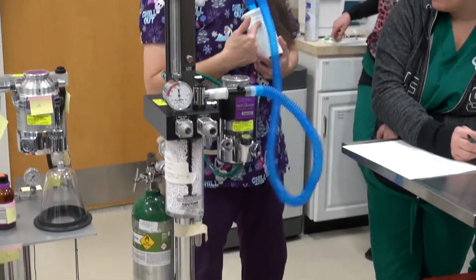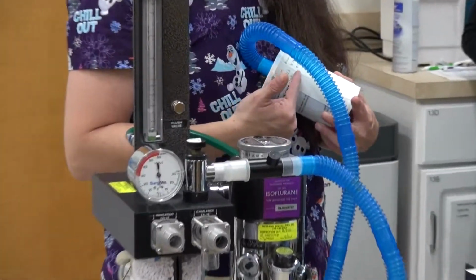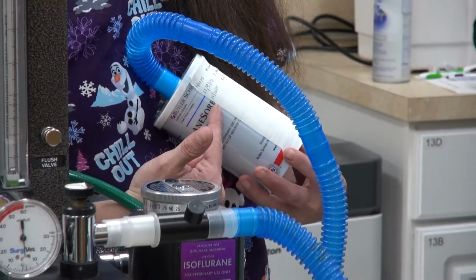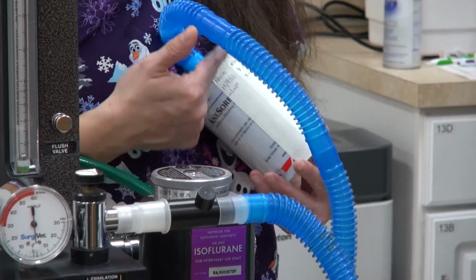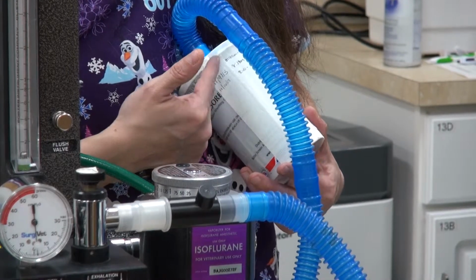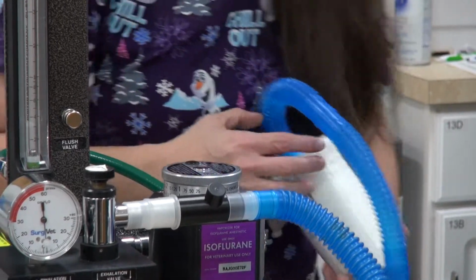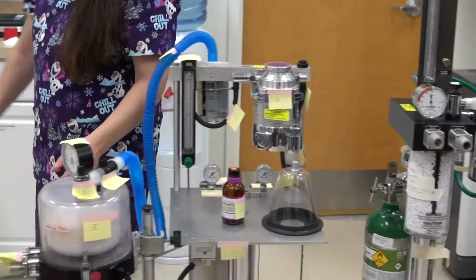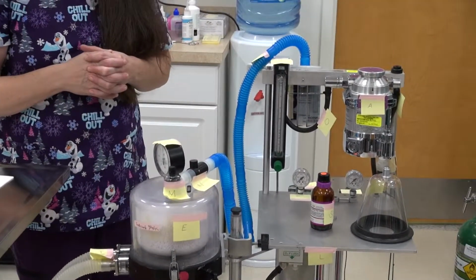We want to check our canister, correct? We want to make sure we have enough time on our canister for the procedure that we're going to be doing. If we're doing a lengthy surgery, we might have to change this, okay? We might not have enough time on our canister, so always check your times on your canister. So we check the total amount used.